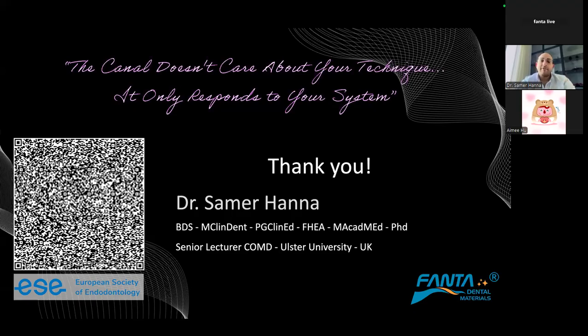However, if you are using the EDTA gel, don't use with it any rotary instrument, because with the rotation and the viscosity of the gel or the cream and the debris, it will increase the clogging over the file and will increase the level of tension over the file. So again, just to sum up, use the gel and the cream with the manual file.